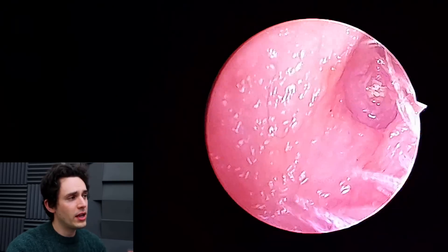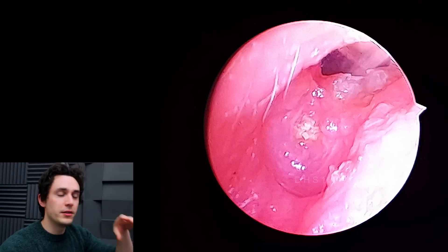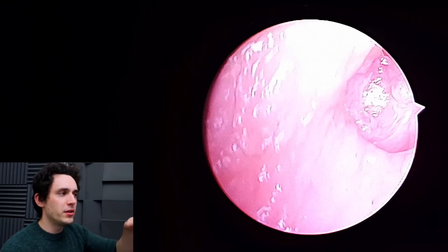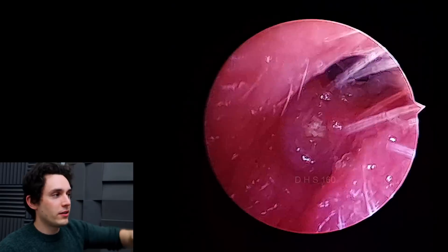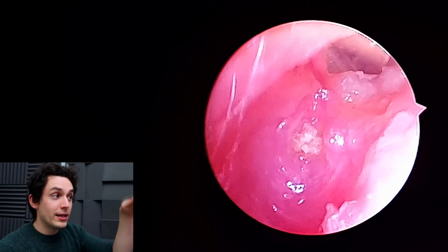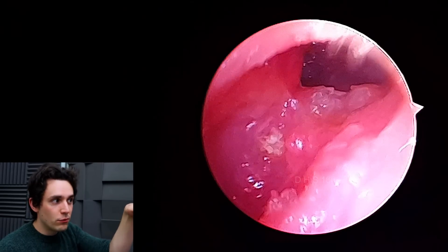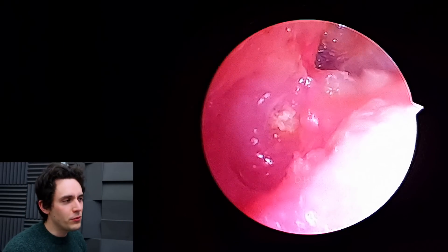So this patient came into clinic. This is a 30-degree endoscope, by the way — a zero-degree endoscope looks forward, but a 30-degree endoscope looks up by 30 degrees. So what I've done is basically got upside down and I'm looking down into the ear canal. Although the rod is straight, it's giving me a downward view, so you can see I'm kind of above the ear canal now.